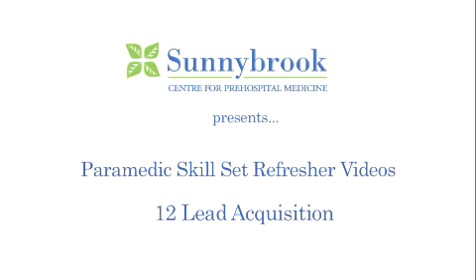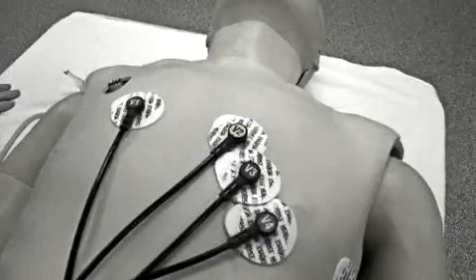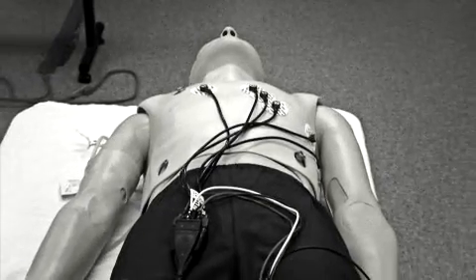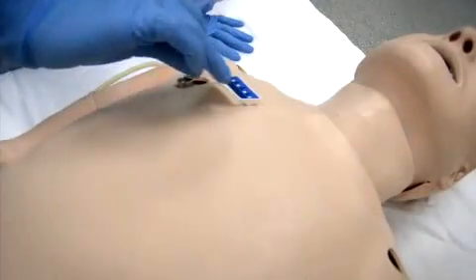12-lead acquisition. In patients that are actively being treated for real or suspected cardiac ischemia, a 12-lead ECG can be acquired to determine if the patient is STEMI positive and falls in or out of STEMI bypass guideline criteria.